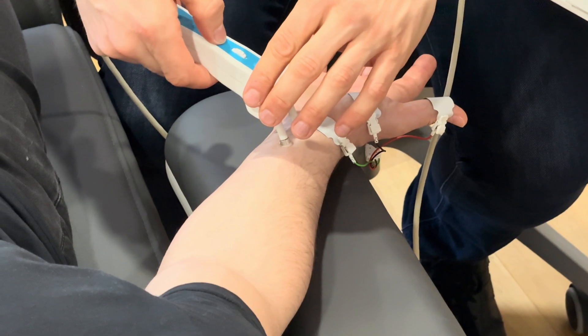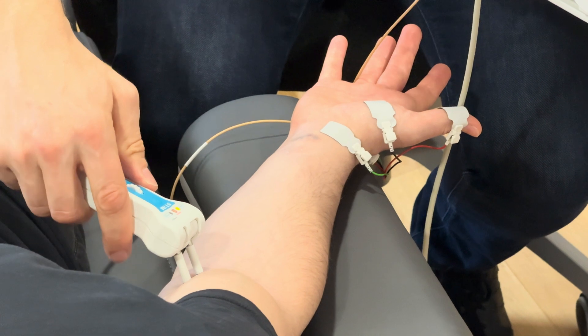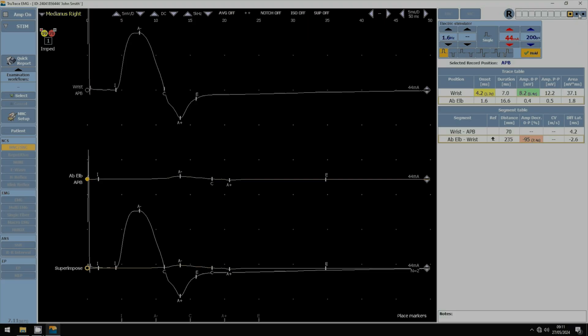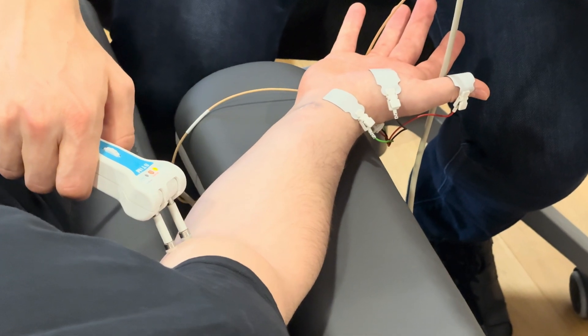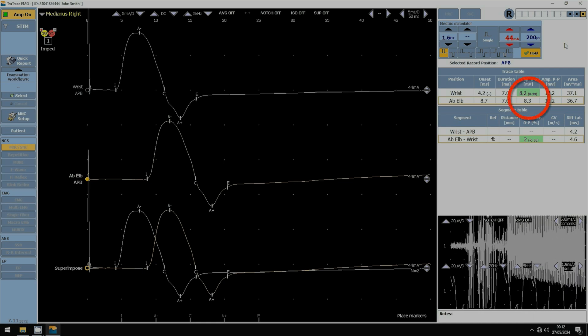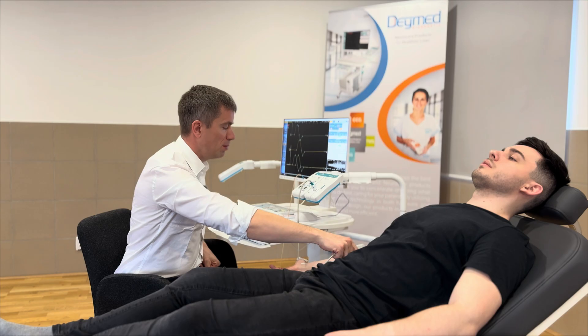Now I move to a place for the proximal stimulation on the medial side of the biceps brachii muscle. At the same intensity I give one stimulation and I have a small answer. I change position of the stimulator and the answer gets a little bit higher, meaning I am better over the proximal median nerve. I change position a little more and the answer gets even higher. We see that at this stimulation I get the same amplitude as the distal supramaximal stimulation — a supramaximal response.